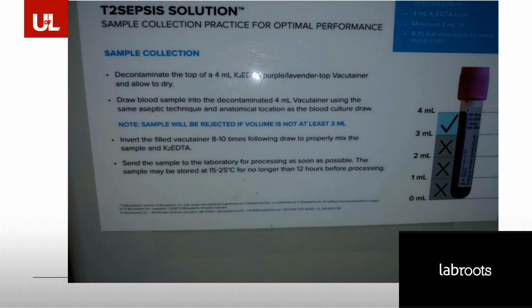As a result of that, it's starting to work very well, but this is one of the learning situations we had because there is turnover in nursing, there is turnover in phlebotomy. So it's a constant reinforcement to ensure that the uniformity standard that we tried to set is maintained.